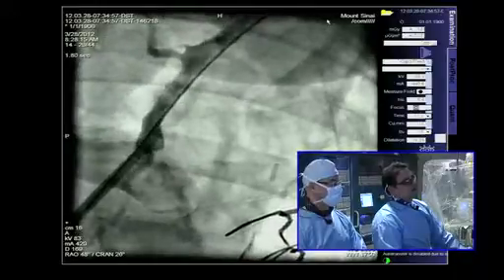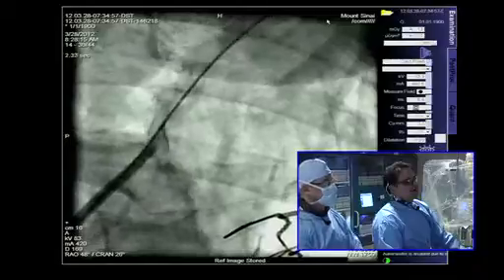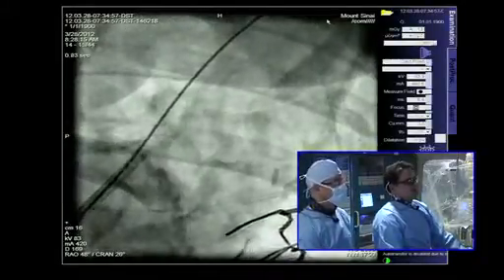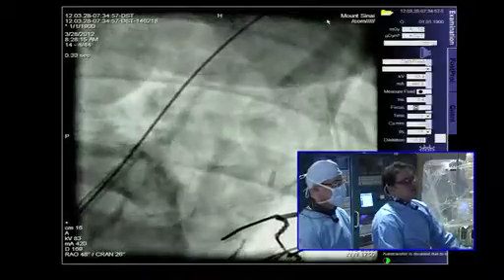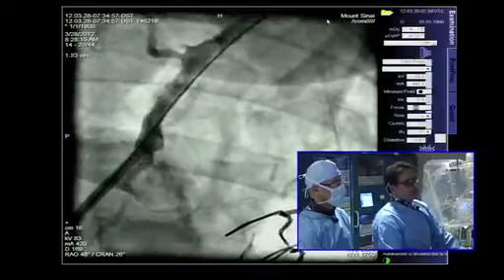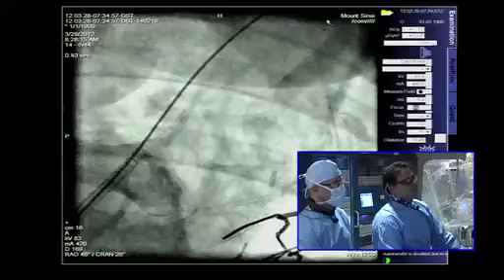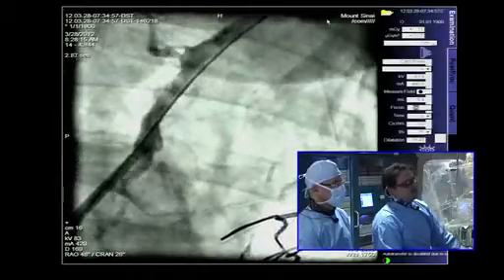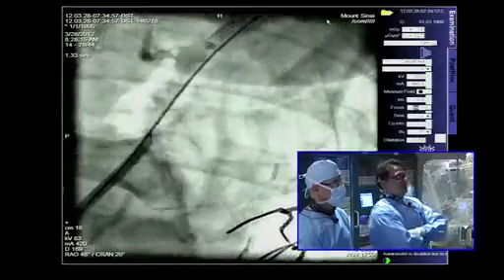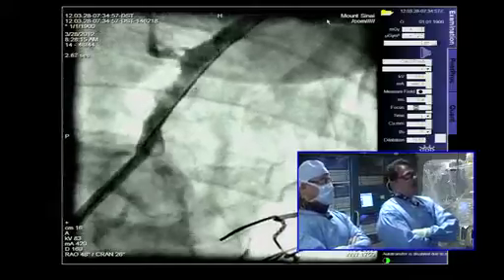So now at this stage, it's a judgment call, George. I really believe that you want to say to yourself, hey, what do I want to do? Do I want to put a balloon expandable or self-expandable? For me, with the level of calcium here, and with the fact that we have to be precise in our stent placement, I'm going to elect to go with a balloon expandable stent at this level. And also knowing, even though subclavian disease is classically aortic plaque extending, there's absolutely no gradient at the level of the ostium here. Yeah, so exactly.